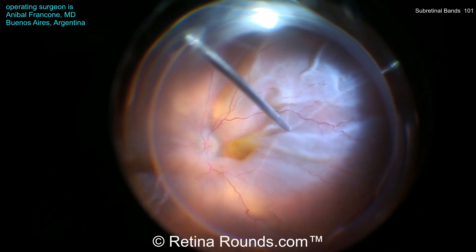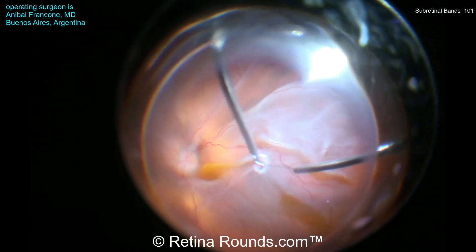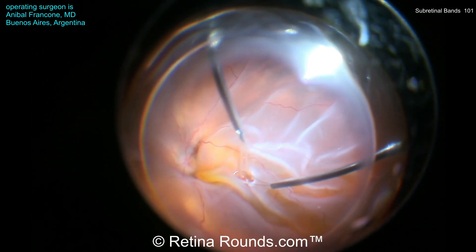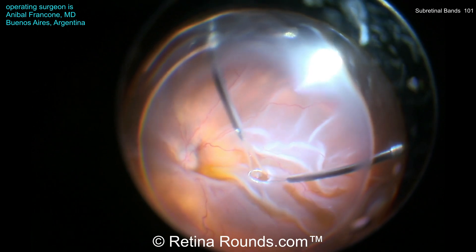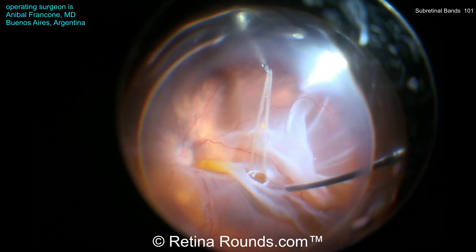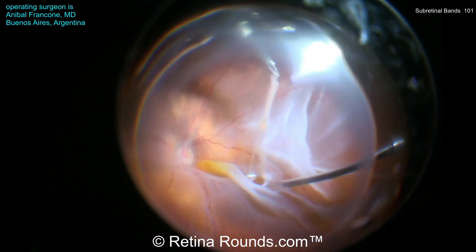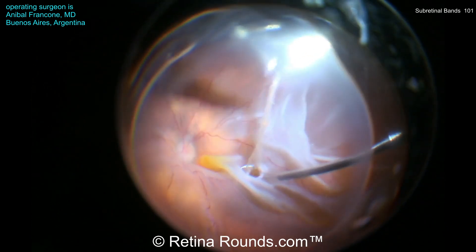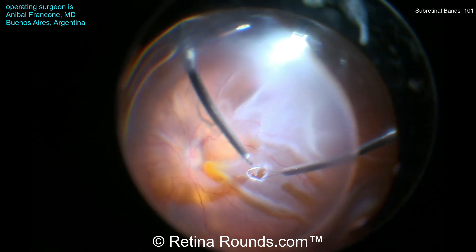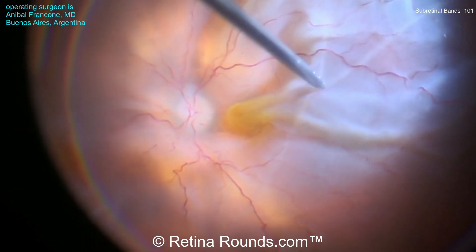Let's see this technique in action. You can see the subretinal band located in the temporal macula. Diathermy is used to create a retinotomy, and the flex loop is used to cover the retinotomy site, holding the retina down while max grip forceps are used to grasp the subretinal band and extract it. As that band is coming out, without countertraction the entire retina would be pulled up, the retinotomy site may expand, and a number of other complications may occur.